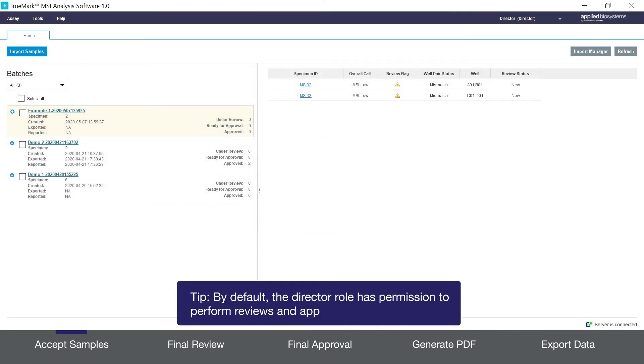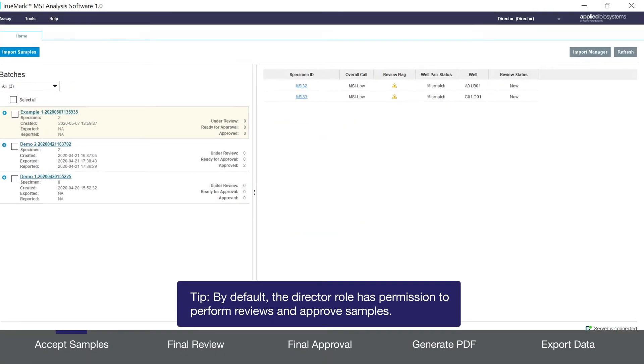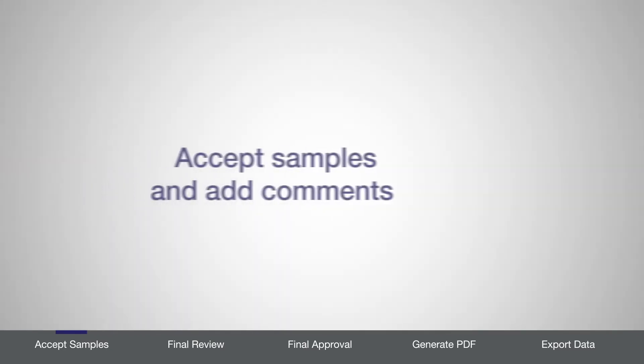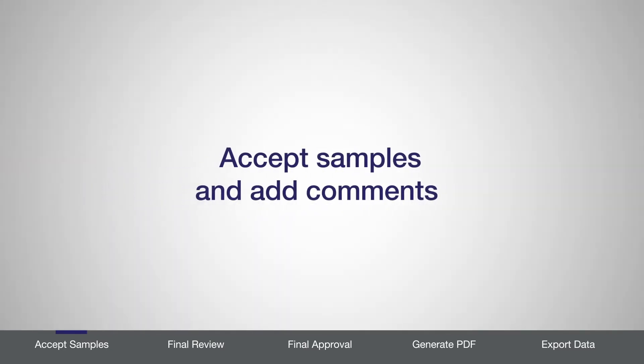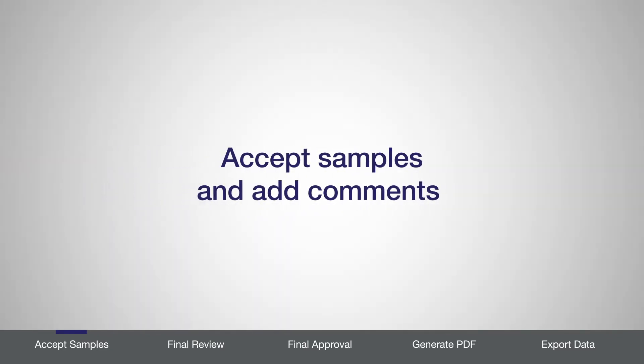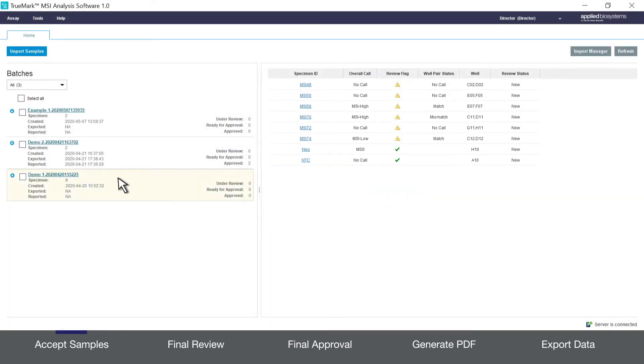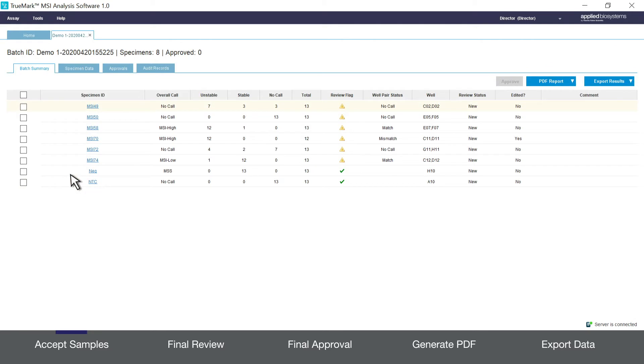For the purpose of this video I'll be logged in as a director. First I'll show you how to accept samples and add comments. Select a batch from the home screen. Click on the batch name in blue and open the batch details.